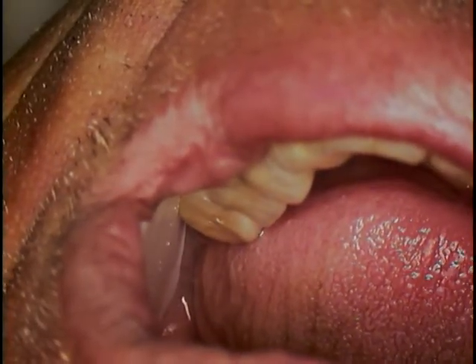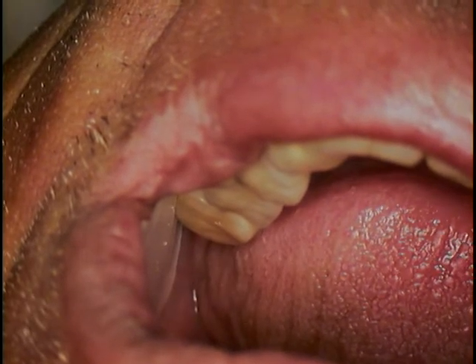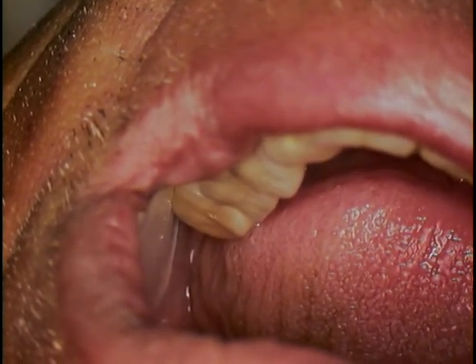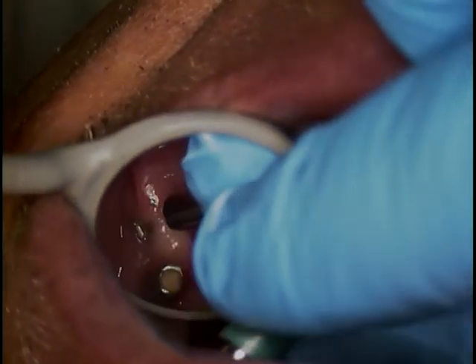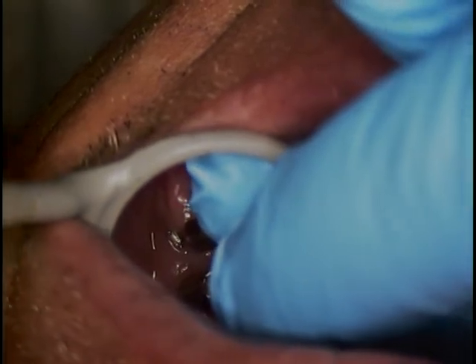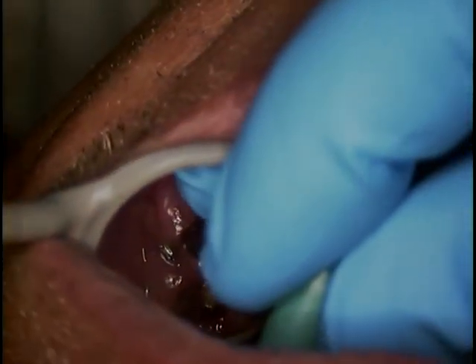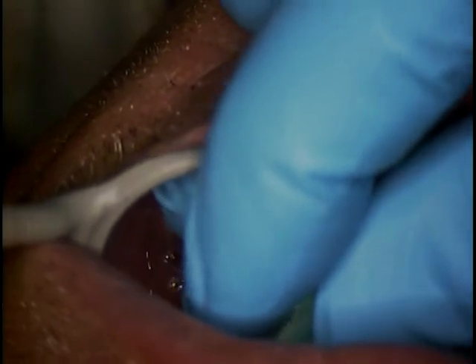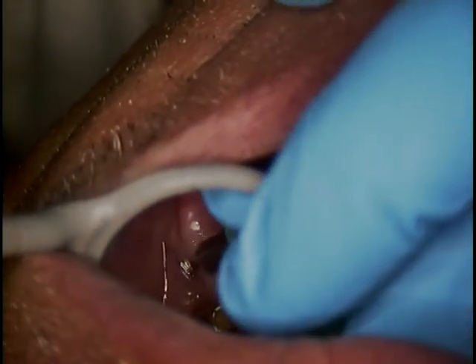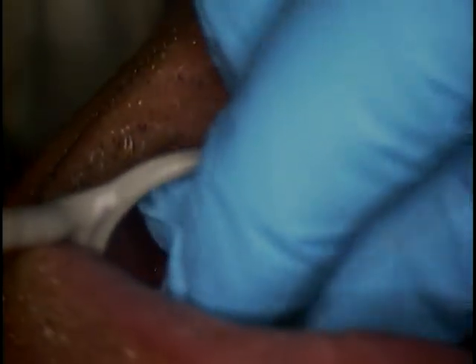I'm going to initially go with a 4-O. We're just going to take some of this tissue away. Coming in from the lingual aspect now, coming right over the top of the implant, and doing a circumferential guiding.